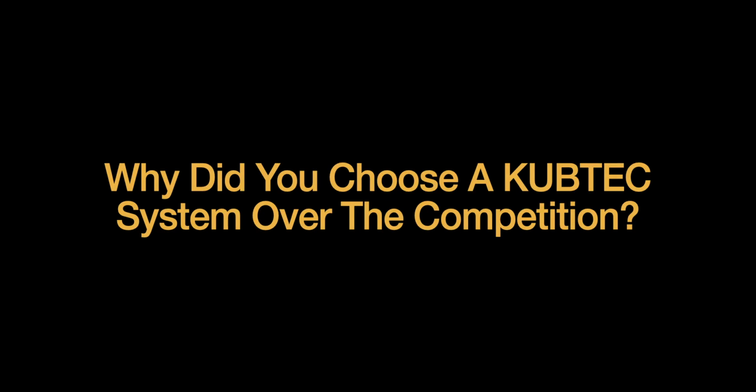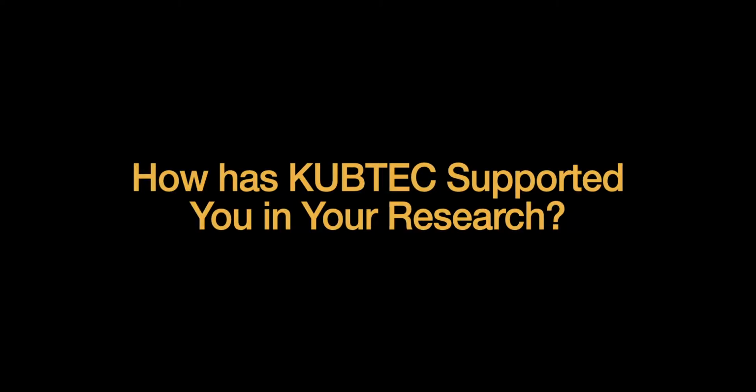When I was researching the different systems that I would want to add to my laboratory, I chose the Kubtec system primarily because of its functionality. When we were looking for a cabinet X-ray system, I was also looking for a system where we could measure bone mineral density and body composition. And the Kubtec system had the best options available.